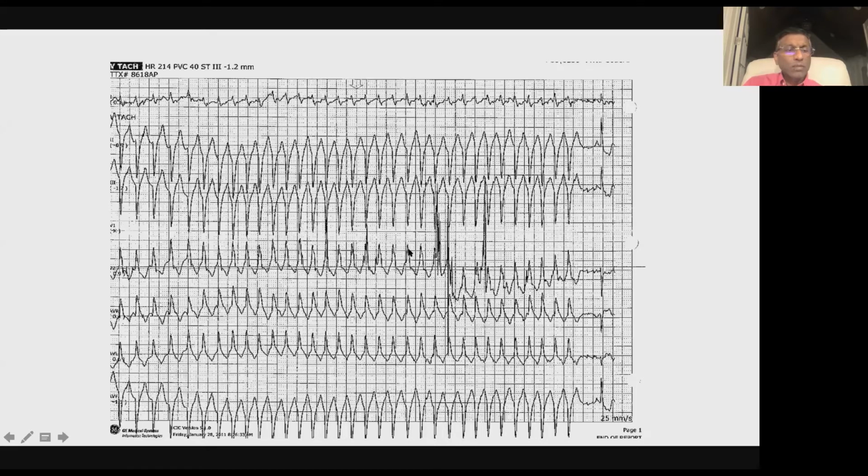Now, there's one more little piece here, and I'm glad you picked up the P wave, because I do think that could be a candidate for a P wave. It just said it's not a sinus P wave. I think there's a little glitch over here. You can see that in the slope of the ST segment, there's a little notch there. So I think this is part of a P wave.